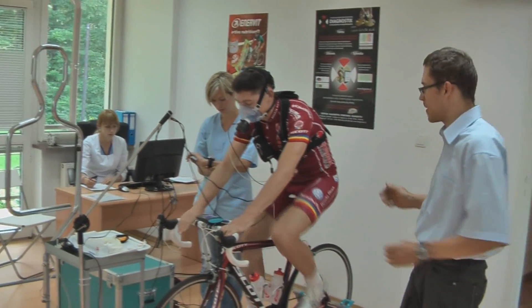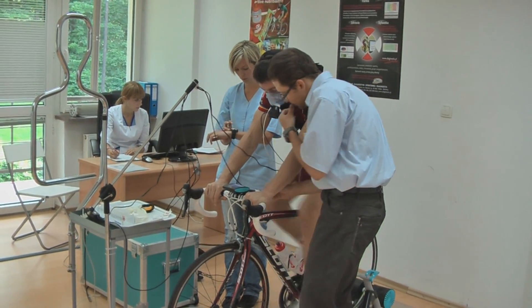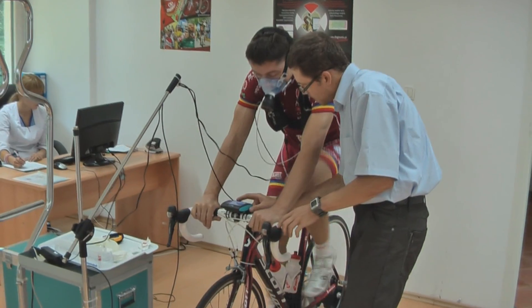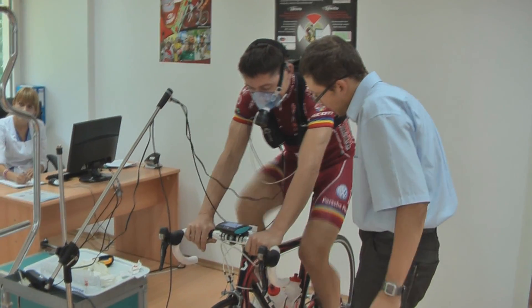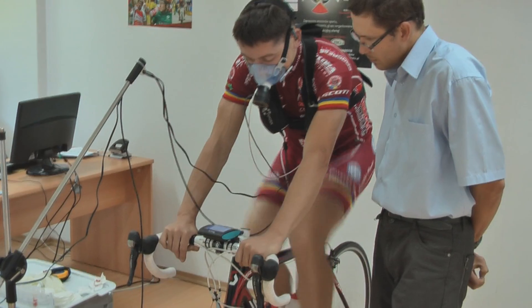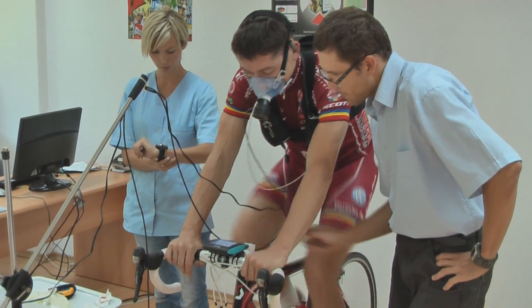We have already started the test. Your aim is 50 watts now — 50 watts.